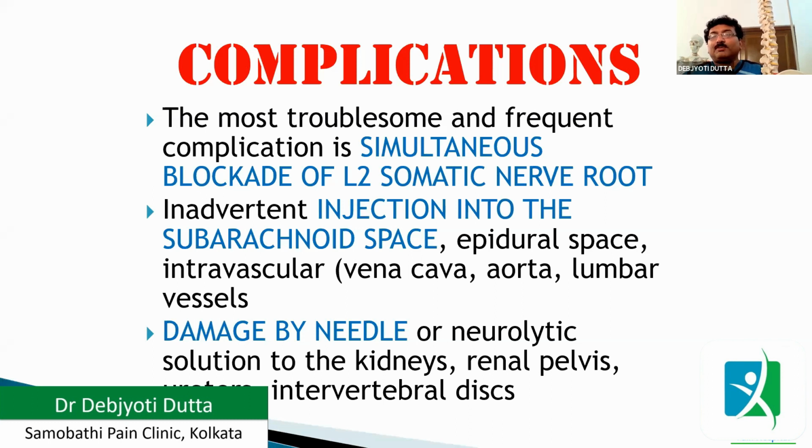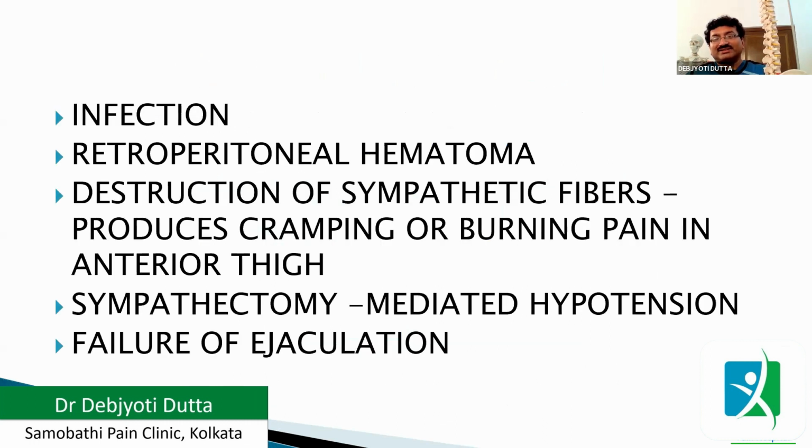Now coming to the complications. The most troublesome and frequent complication is simultaneous blockage of the L2 somatic nerve root, and inadvertent injection into the subarachnoid space, epidural space, or intravascular space. If you are not careful enough, if you have not checked with the dye, then you might go to these areas. And with the needle or the neurolytic solution, you might damage the kidneys, renal structures, ureter, or the intervertebral disc. So you have to be careful, and if you are doing it under fluoroscopy and carefully, then these chances are comparatively less.